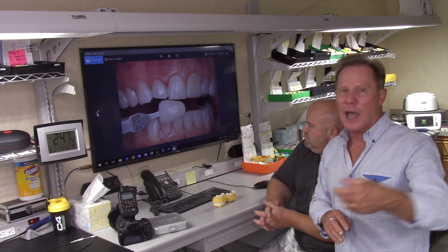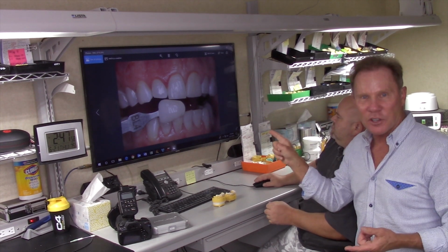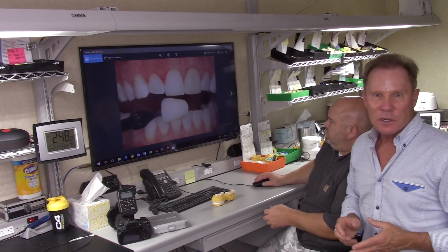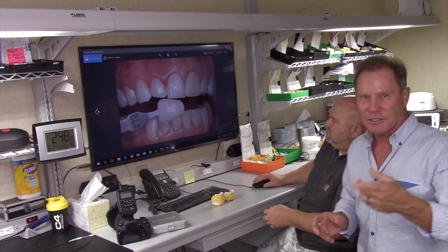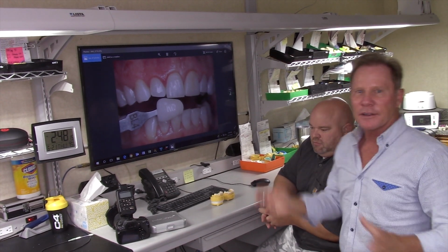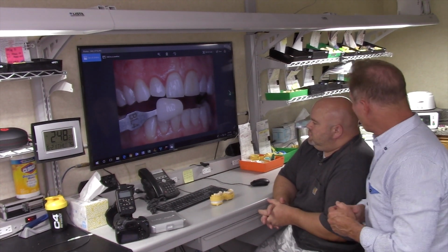Don't just send it back with another prescription. Photograph it. The polarizing filter, because of value, all of a sudden will just point that out almost immediately, that we're at the wrong value. So lots of times the ceramists call that first crown, especially if you didn't communicate adequately the first time, a custom shade tab. They look at it and say, oh, that's what they meant by that. But if it's polarized, it's even that much more powerful. Anything you want to add to that?